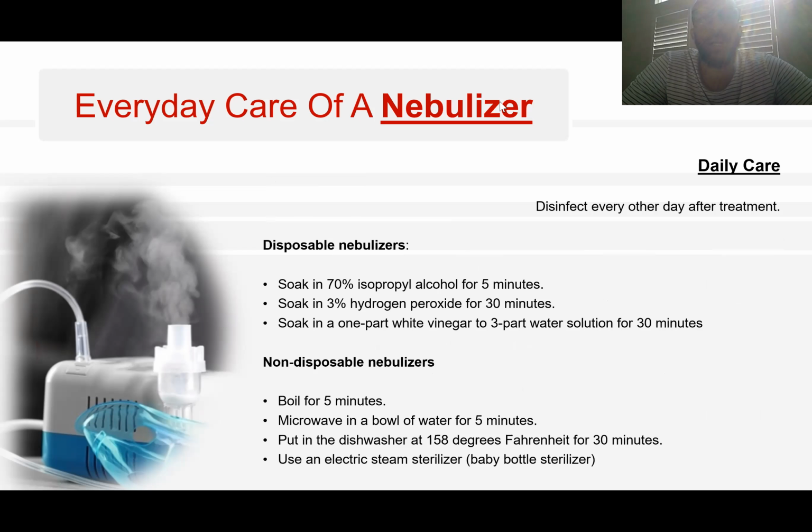Now, some more information for disposable versus non-disposable nebulizers. So, of course, for disposable nebulizers, there are 3 different ways to disinfect them after treatment. But if your facility does not want you to disinfect and they want you to dispose and not try and save things and be frugal, that's fine too. Just throw them away and get a new one.